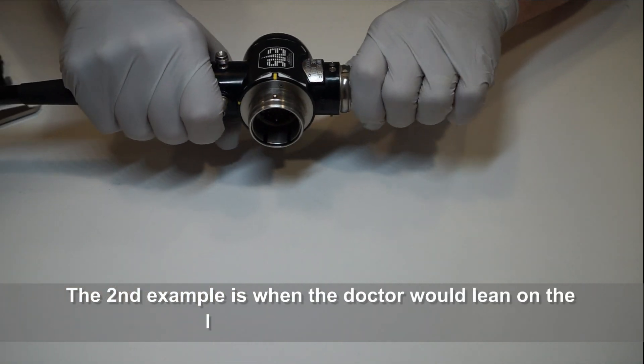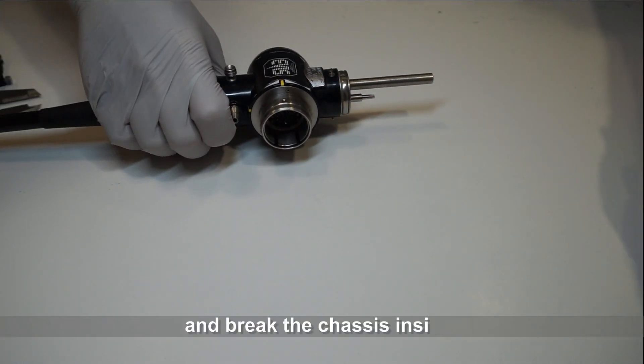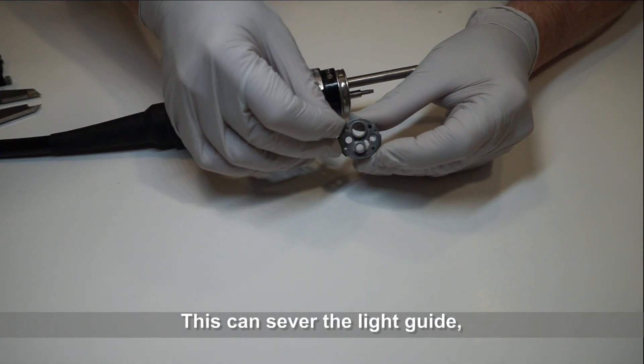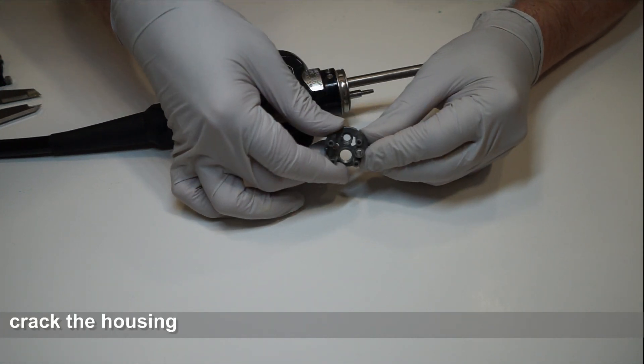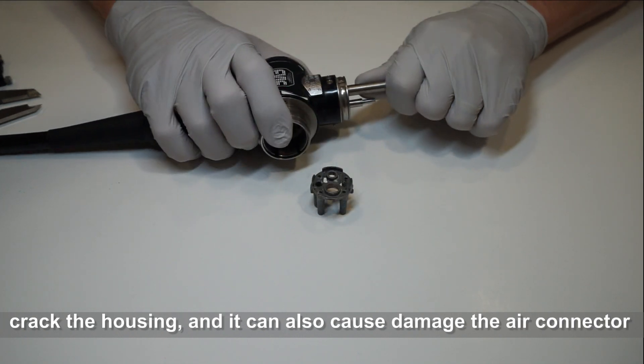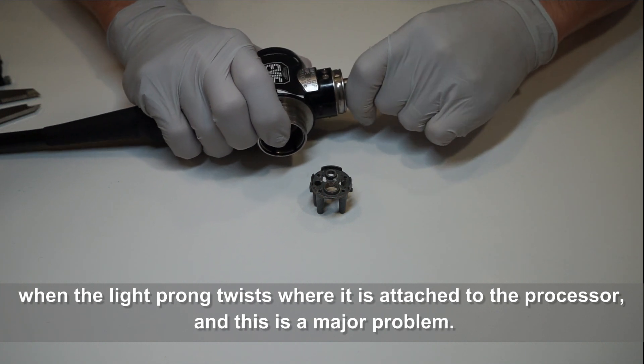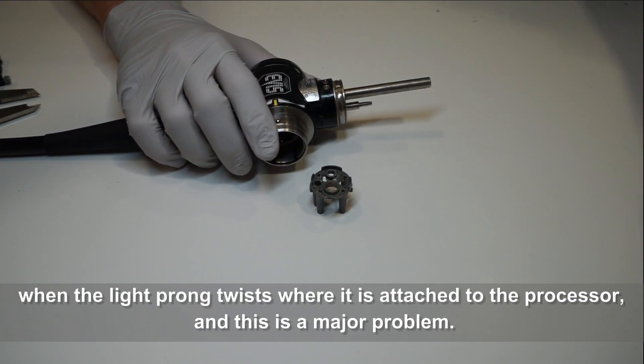The second example is when the doctor would lean on the light guide connector assembly and break the chassis inside. This can sever the light guide, crack the housing. It can also cause damage to the air connector when the light prong twists where it's attached to the processor. And this is a major problem.